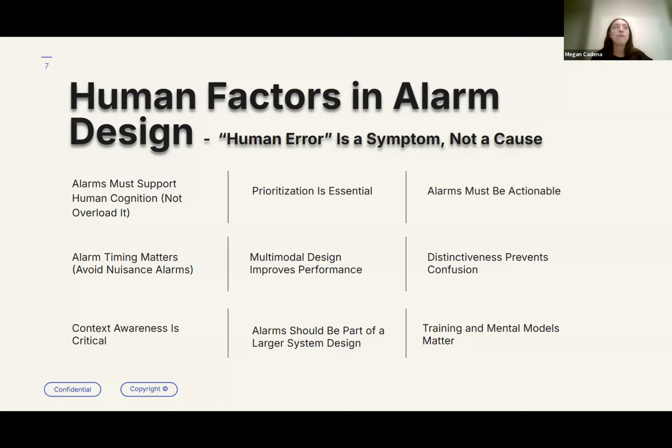Critical care settings have, let's say, infusion pumps, ECMO machines, ventilators, as well as dialysis machines. And those are just four. Typically, they're surrounding the beds and very overwhelming with high decibel sounds, multiple alarm LEDs, and different cues. So imagine the stress that can inflict on an intended user. With this in mind, you have to think about what a human can really process in these settings, and also what mental loads they can bear. And this is important for the design because it goes into risk mitigation.